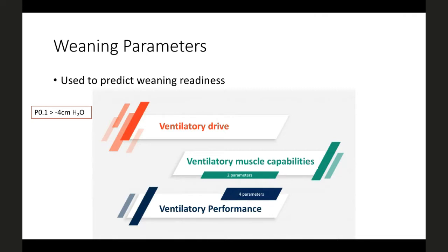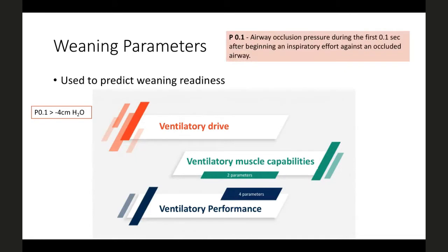Don't get scared. It is the value given in modern mechanical ventilators. It should be more than -4 centimeters of water. It is the airway occlusion pressure during the first 0.1 second after beginning an inspiratory effort against an occluded airway. So that is the checking of ventilatory drive.